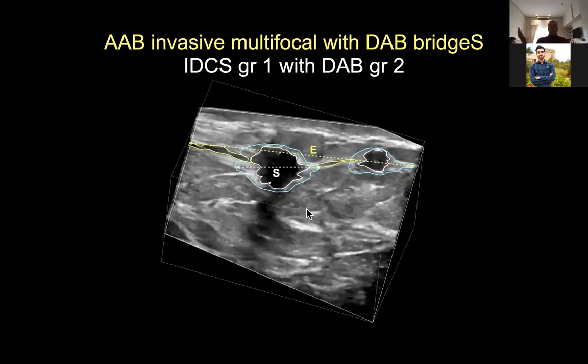Now, in terms of documenting this for your pathologist, we probably rely too much on MR in the United States, because when you're in the room deciding on whether you're going to do an ultrasound cored biopsy, it's really easy to just extend your exam to include the whole breast, to try to find all the DCIS components, all the multifocal lesions, and then to plan mapping biopsies right at the time of your original biopsy. Well, stage the lesion as best you can with ultrasound, even before the MR.